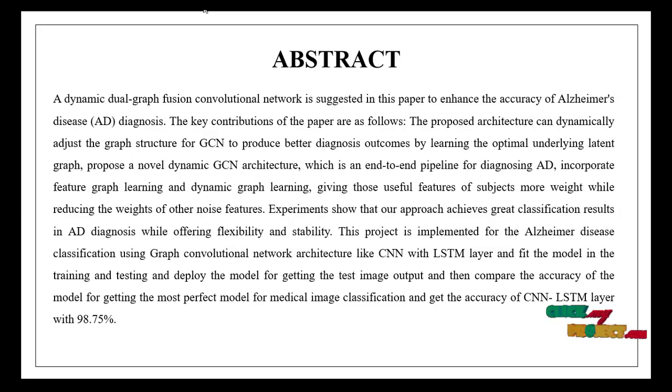This is our abstract. A dynamic dual graph fusion convolutional network is suggested in this paper to enhance the accuracy of Alzheimer's disease diagnosis. The key contributions of the paper are as follows.